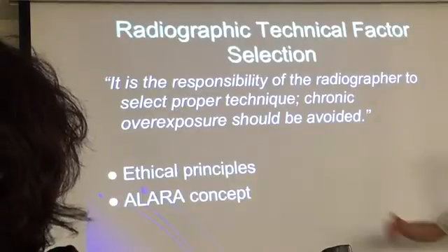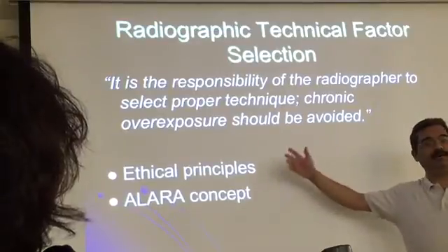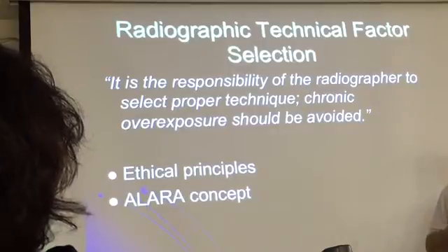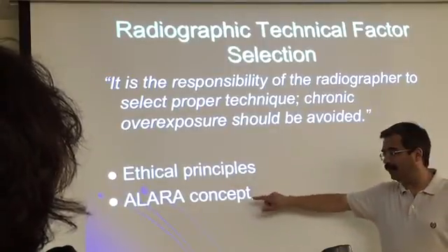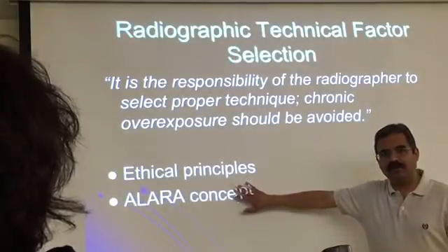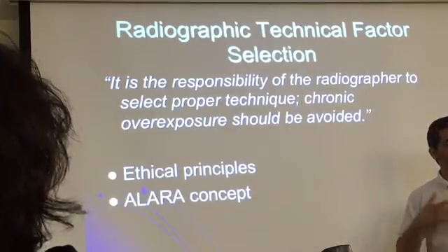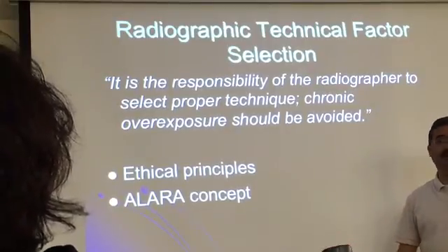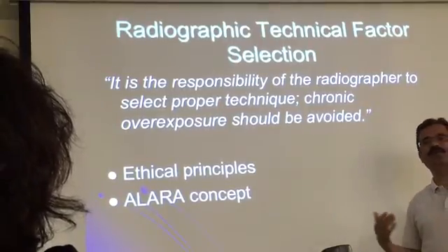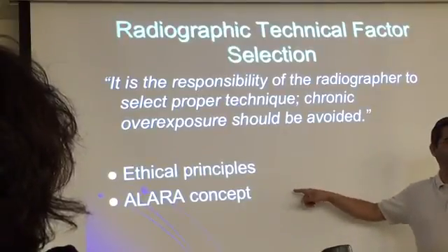Radiation can do damage. We might not see it in 5, 10, 15 years, but you can inflict damage on the patient, so it's something to keep in mind. The ALARA concept has to be always there. Why? Because these systems offer you the opportunity to overexpose patients, and still the images look perfect. That's what is so deceiving: your image will look beautiful even though you are overexposing a patient.